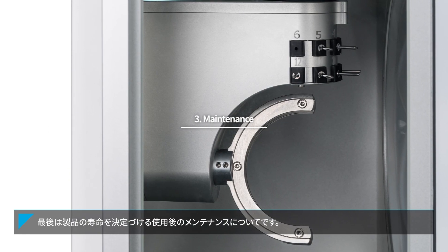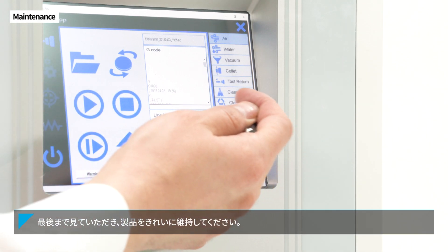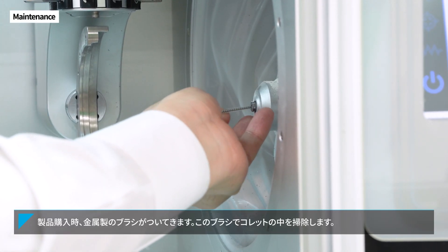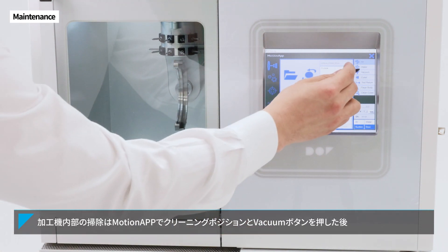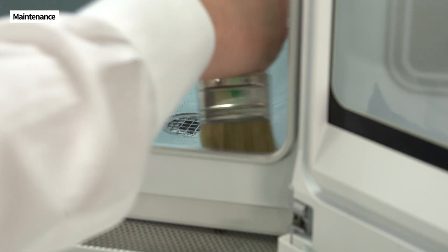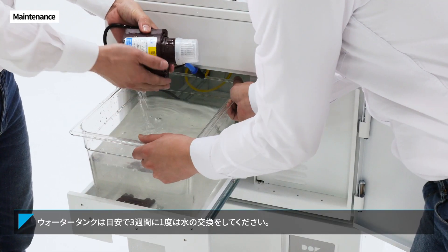Maintenance. What about maintenance? Post-use maintenance determines the life of the product. Please watch to the end of this video and keep the product clean following the correct cleaning method. When you buy the product for the first time, an iron brush will be provided. You need to clean the inside of the collet with this iron brush. To clean the inside of the milling machine, press the cleaning position and the vacuum button on the computer, and remove any remaining powder with the brush. To clean the dust collector, take it out and empty the dust bin. As for the water tank, just replace the water once every three weeks.